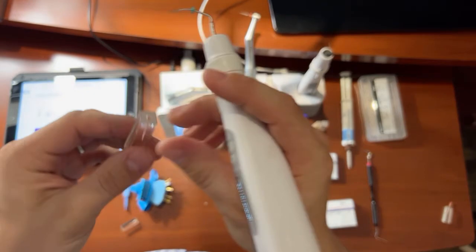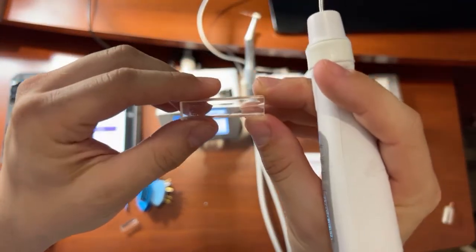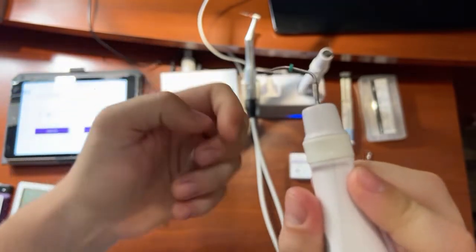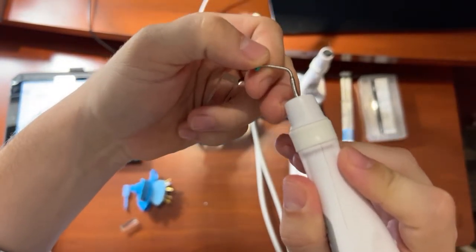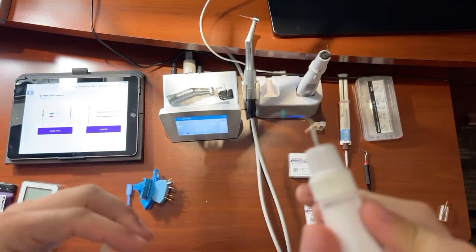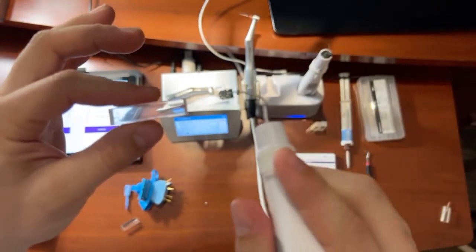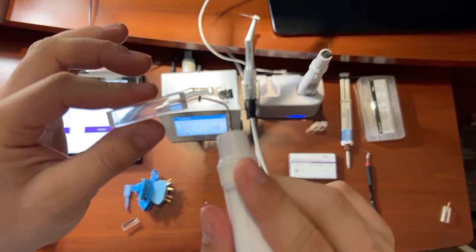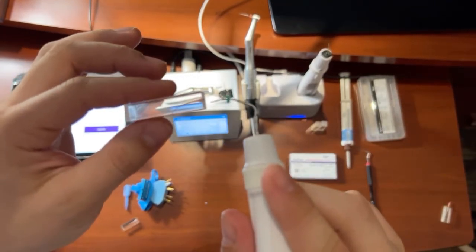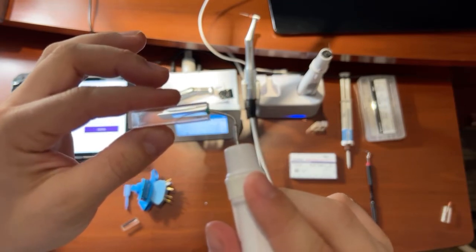So after we've done all of those steps, what we're going to do is pre-fit this plugger about 5 to 7 millimeters away from the apex, okay? We do that because we're trying to create an apical plug. Then we have 4 seconds to shoot down and get to that predetermined length to create the plug.